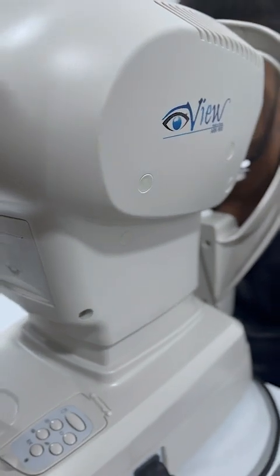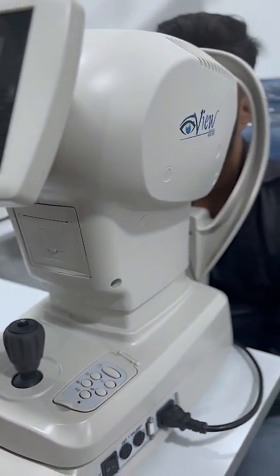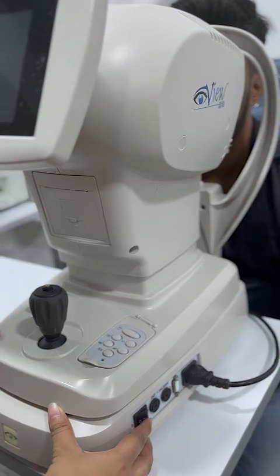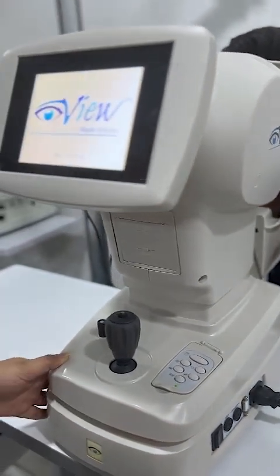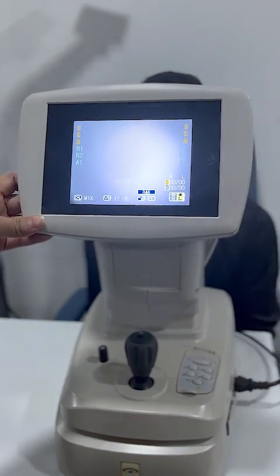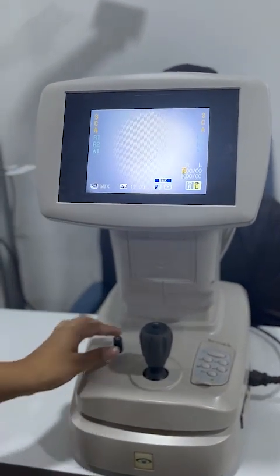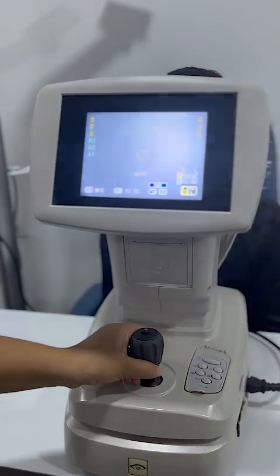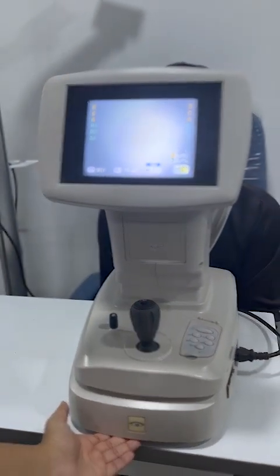This is the iView ARK900 autorefractor keratometer, and this is the main power button. This is the main screen we get after turning it on. This is the temporary lock you can do here, and below we will get the permanent lock.